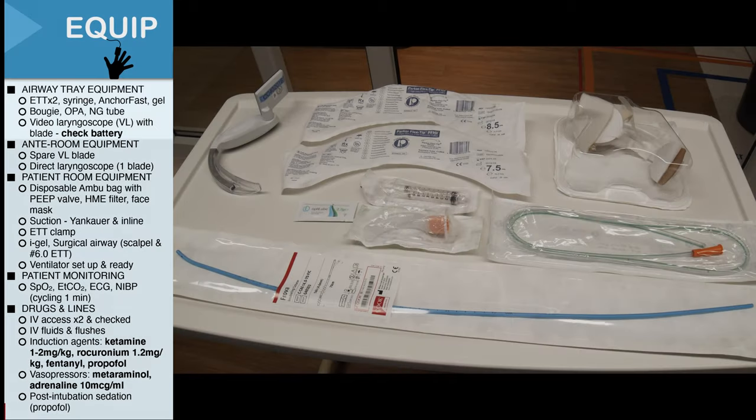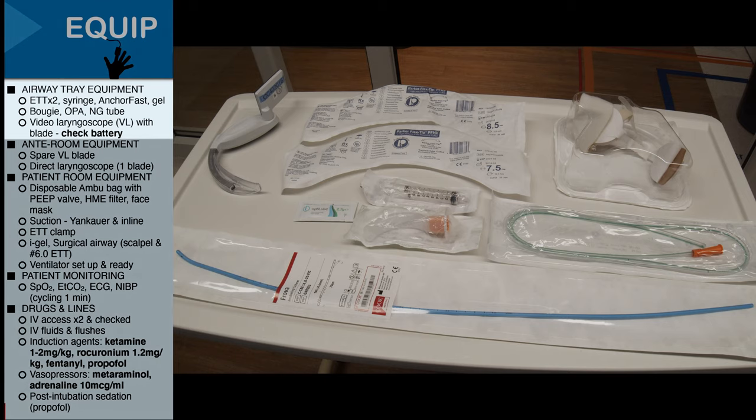Starting with the airway tray, this will be pre-prepared outside of the patient's room and should be checked through thoroughly to ensure that nothing is missed prior to entering. In this box will be two ET tubes, a syringe, anchor fast for securing the tube, some lubricant gel, a bougie, an oropharyngeal airway, a nasogastric tube, and a video laryngoscope with one blade.